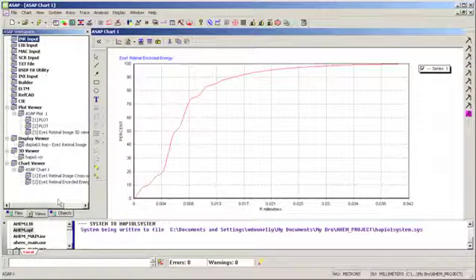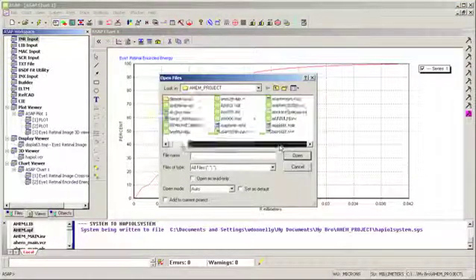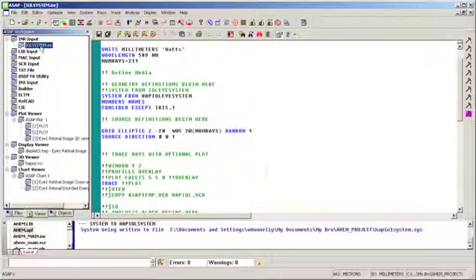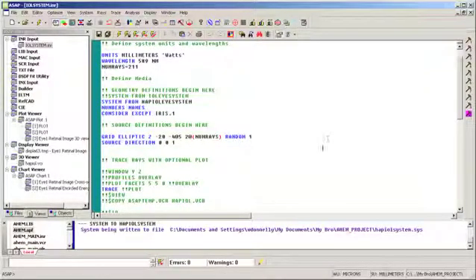So next thing I want to do is load my system file for that, for generating my IOL appearance modeling. Here it is. All right, so what's going on here now is I've got another ASAP file that employs that system by recalling it. So I've created an entirely new system where I'm going to remove the iris and then do the IOL appearance modeling. So here's my system. I bring that back in.